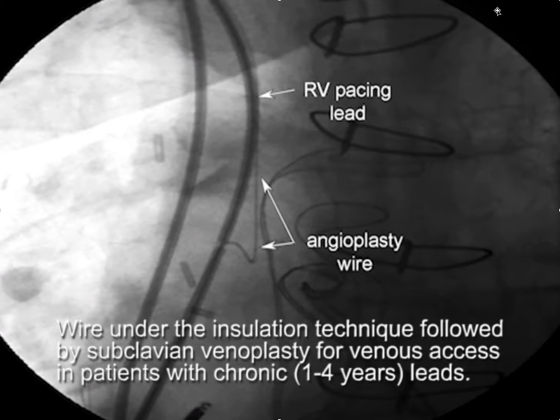Without stopping the procedure to arrange for extraction or going to the other side, the ICD lead was successfully placed. I hope you find this useful. We recently did a case of a patient whose RV lead on the right side was four years old. I always pick the lead that's been in the shortest that has active fixation. And if the lead doesn't move when you release the suture sleeve, you can just re-suture it and consider other options.